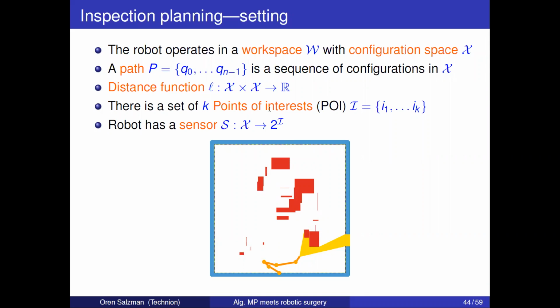It's not like a manipulator where we know everything about them, and everything we do there is also computationally expensive. So when I mentioned FK and IK with the manipulator, it's just a bunch of matrix multiplication. Here we need to run numerical simulations. So from an algorithmic perspective, this is really cool because it gives us a lot of challenges that we really want to re-examine. What is the computational bottleneck that we really wish to optimize over? For example, it's not necessarily collision detection. It's just looking at what the shape of the robot is. That is really complex.